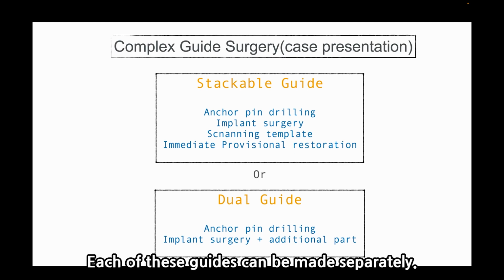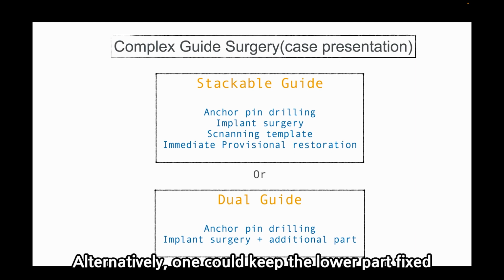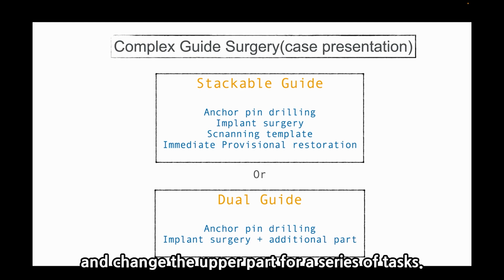Each of these guides can be made separately. Alternatively, one could keep the lower part fixed and change the upper part for a series of tasks.